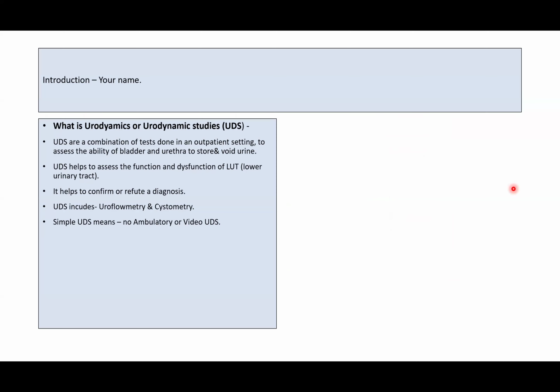Any more graphs we have? No more graphs. Now we have the answer. So in the exam, you will have these pictures in front of you, with the cystometry and uroflowmetry graphs given there. Now this station has been coming in the exam for the last two years. Yes, it has come in the May exam also, because the exam goes on for four days, so there will be any station on any one of the days. Last day, I think it came.